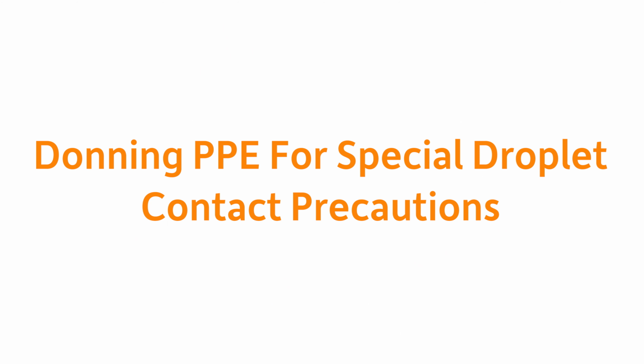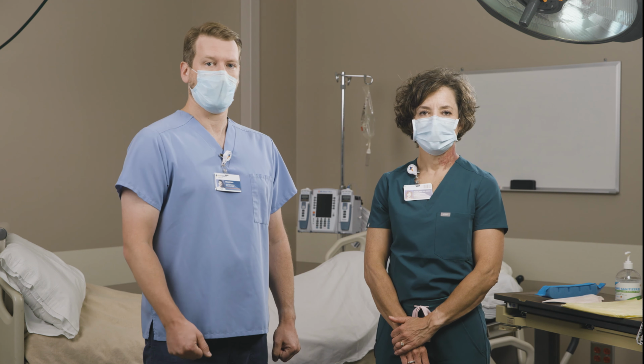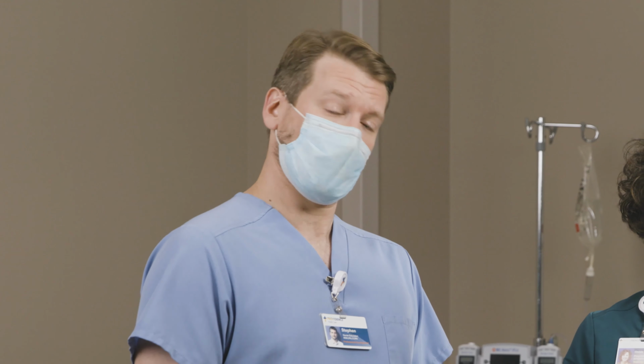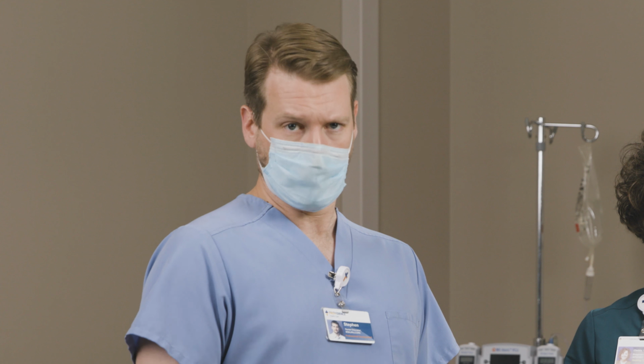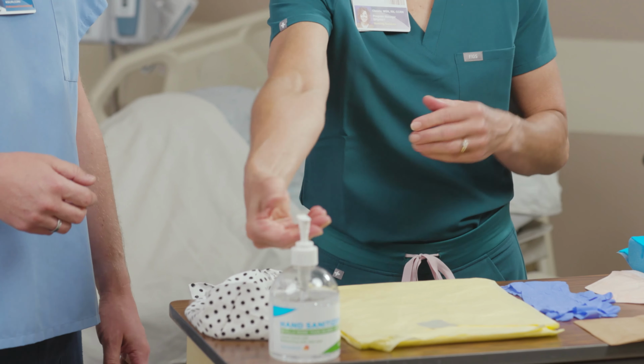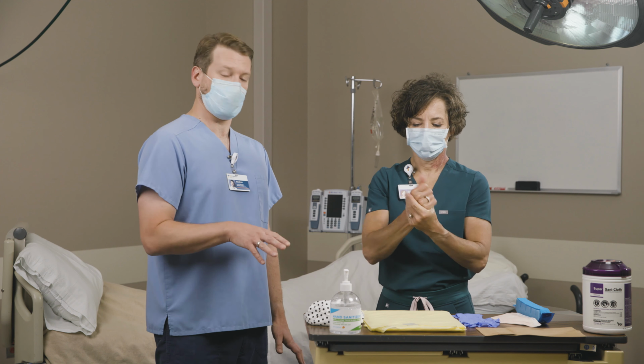First, we're going to demonstrate the COVID PPE ensemble for special droplet contact precautions with an N95 mask and face shield for aerosolizing procedures. We're going to demonstrate this with a single glove, but a double glove technique is appropriate. Krista's going to start with performing hand hygiene. She's then going to secure her hair. Most people choose to do this with some sort of a cloth covering.